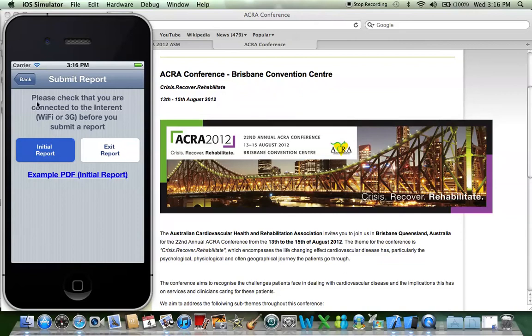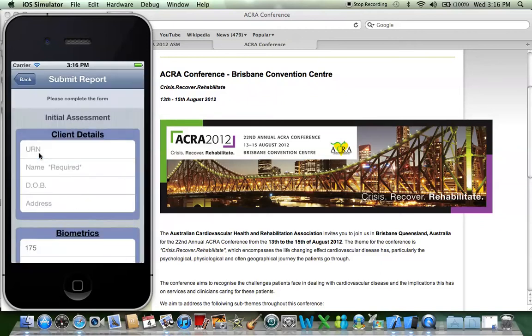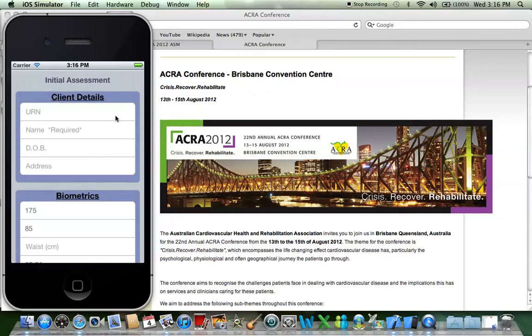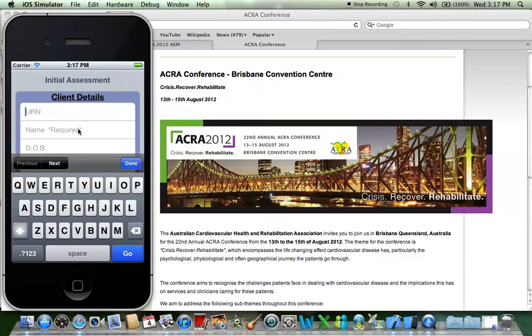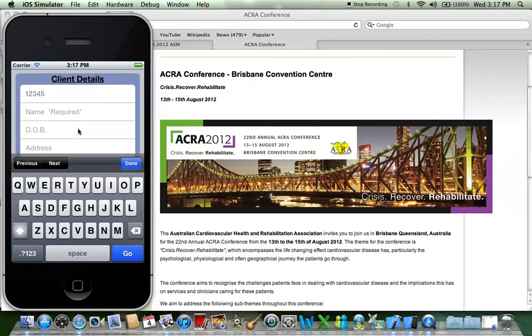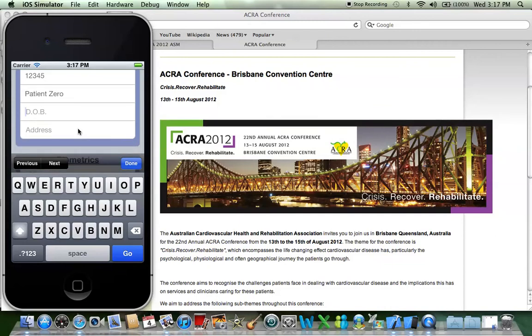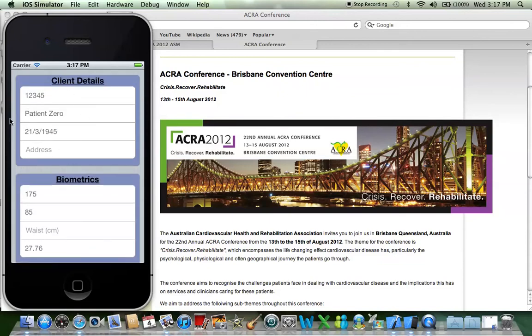When you're sending the report, you need to be connected to either Wi-Fi or 3G or 4G — you need to be connected to the internet whenever you're emailing something. Now, patient confidentiality and privacy is a big thing, especially with your mobile device. The only required field is the name of the patient, so you can just put in 'patient 0' as an alias. You don't necessarily need to fill in the date of birth, address, and UR number. If you really want to uphold confidentiality and privacy, you can print it out, put a sticker on it, and just use an alias.